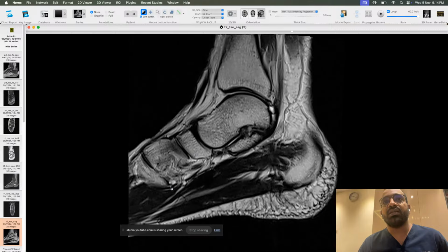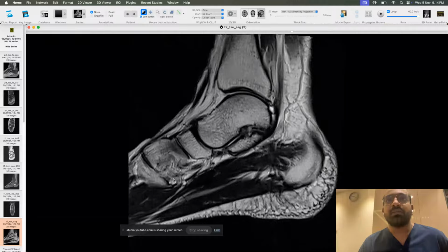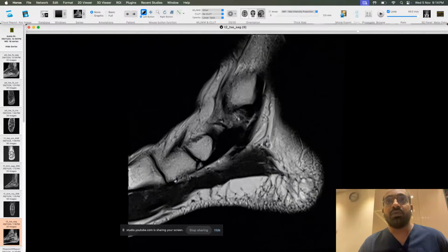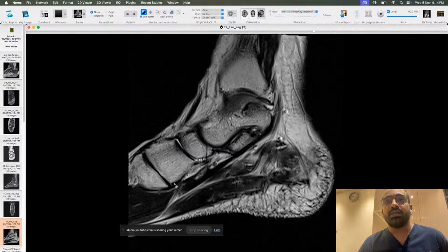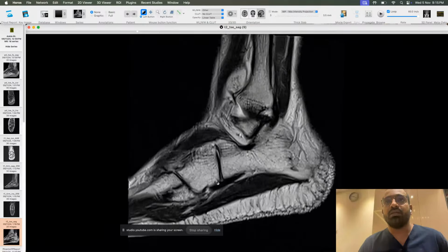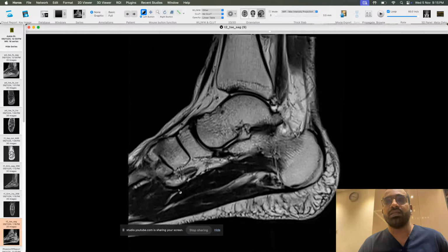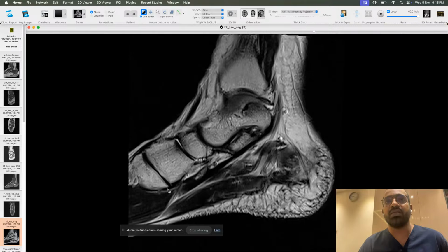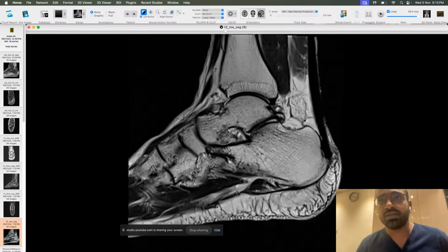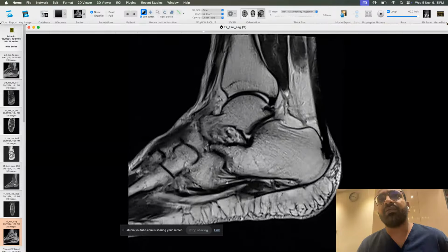So if you can trace it, it will go and insert onto the base of first metatarsal and cuboid bone. Cuneiform bone, medial cuneiform bone. So this is the medial cuneiform. If you see here laterally, we have this cuboid, right? So beneath the cuboid, this peroneus longus tendon goes and inserts onto the base of first metatarsal and medial cuneiform bone. So that helps in maintaining the arch of the foot and dynamics of the foot.